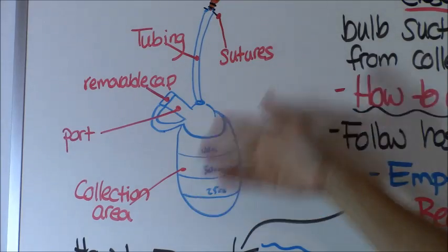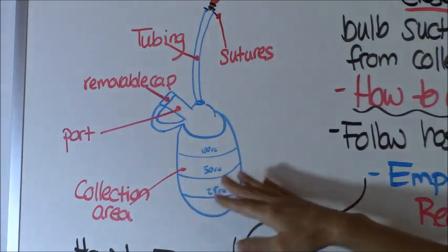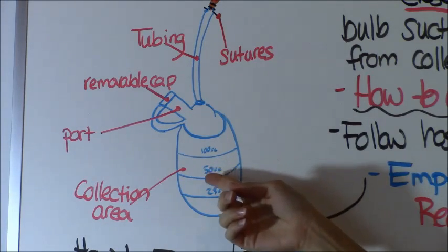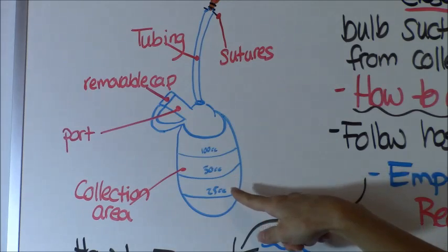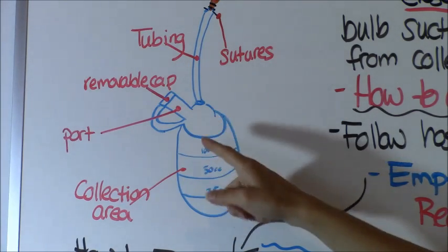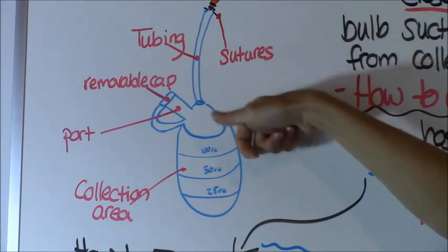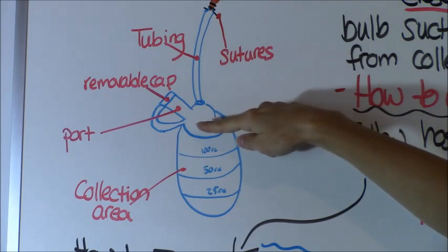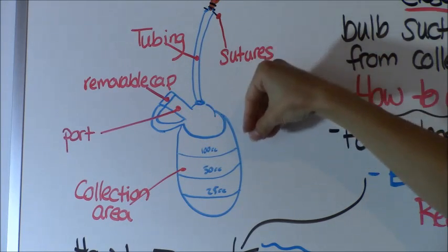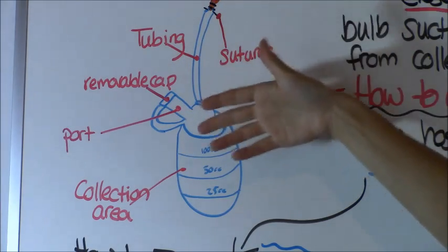As drainage collects, it will expand the bulb out, and once it's expanded it won't create suction anymore so you'll have to empty it. You want to empty this whenever it's halfway full — this is a 100 cc collection chamber, so you'd empty it around 50 cc. To empty it, you have a removable cap with a port on this area. You pop the cap off, turn it upside down, and squeeze it into a measuring cup to get your drainage. It's easy because you can measure it.